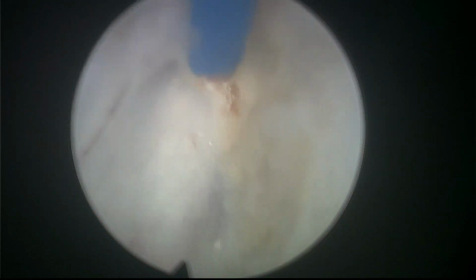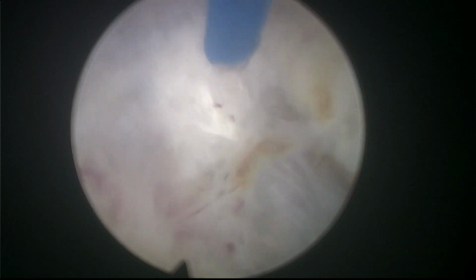So here, you see it's always very careful. You don't need to rush it, but it will end very fast. You see that when you work in these beautiful visibility conditions, concentrating on where to target your laser, what distance from the tissue you want to fire.